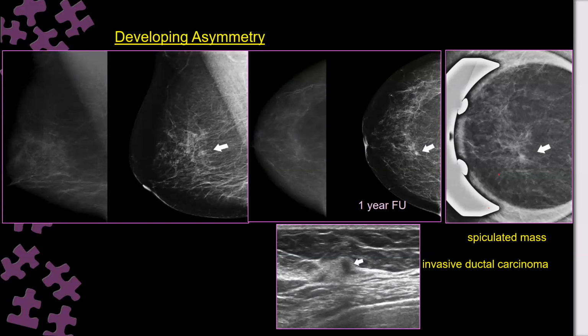So what is the lesson from this? If you go back and look at this, a very faint and small, tiny area. What is the lesson? What benefit of screening do you learn from this case? The importance of screening. Yes, excellent. What else? For us as radiologists or breast imagers, we must perfectly examine the image while we are reading the mammography.